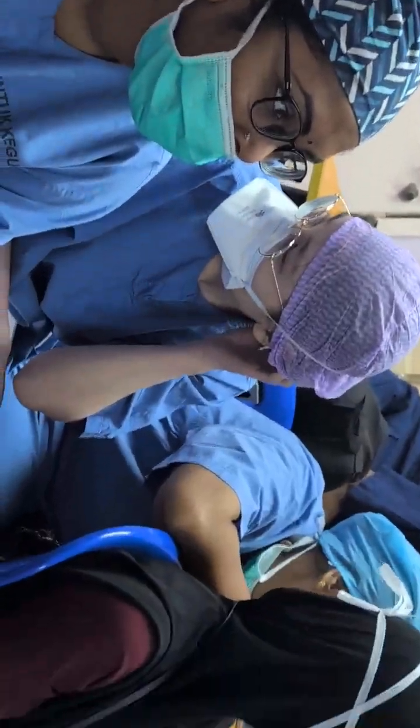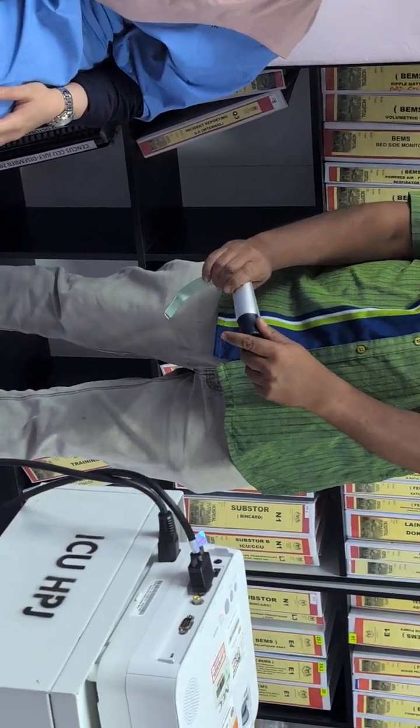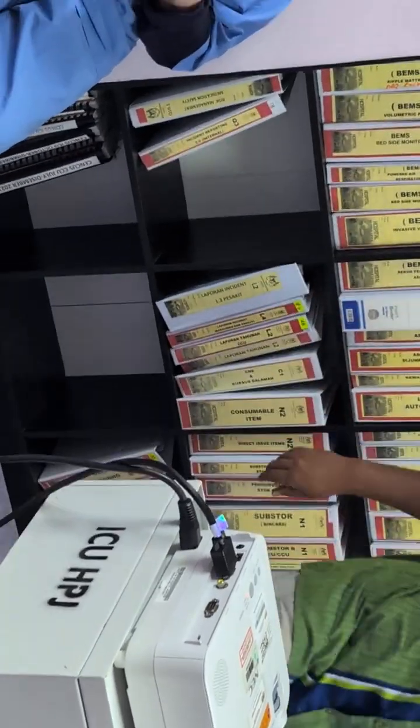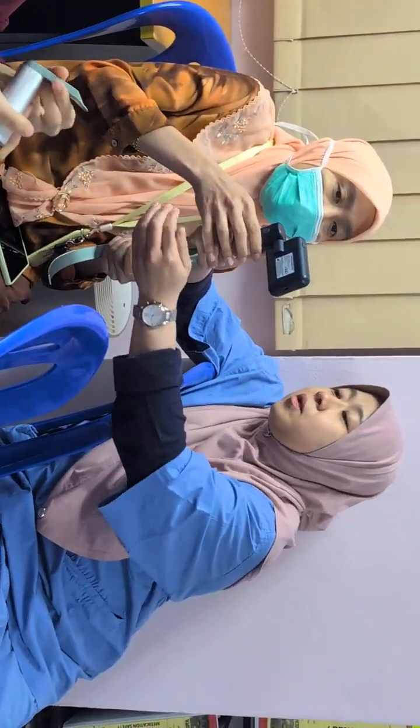So you see, when you put it here, lock, open. Betul. Nice lah. Nice. Very nice. Sebagai modern style.